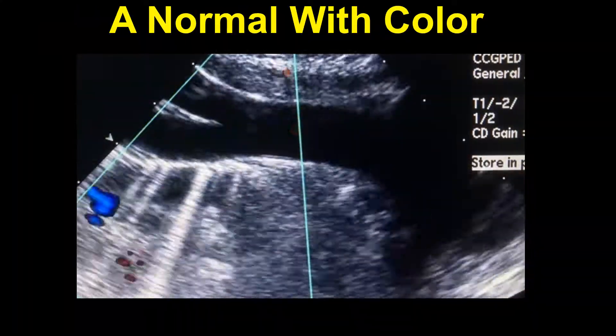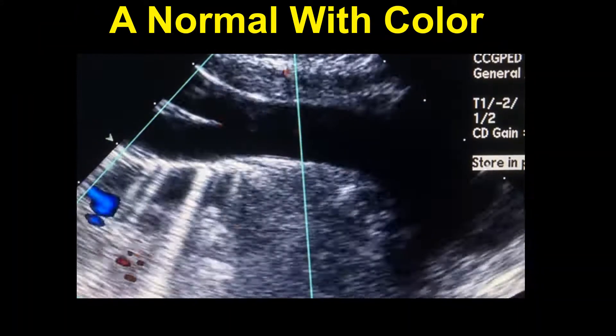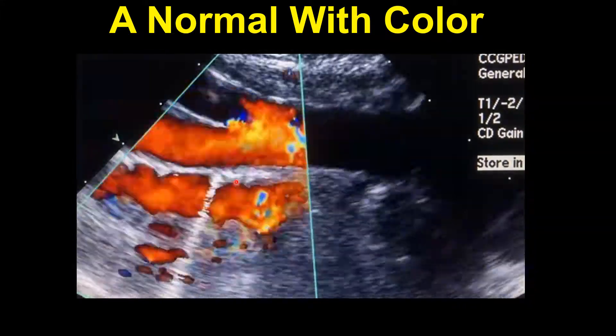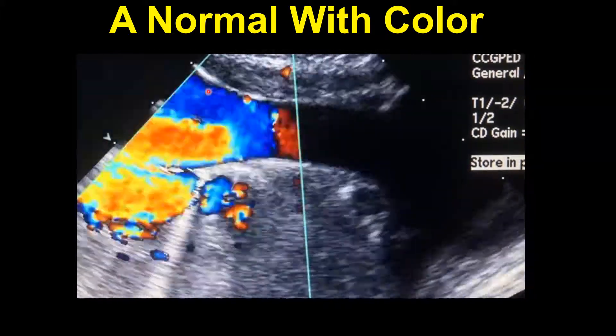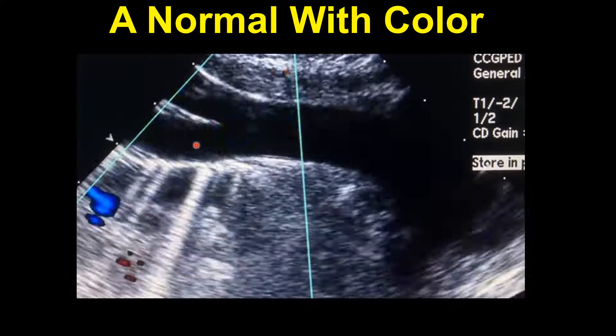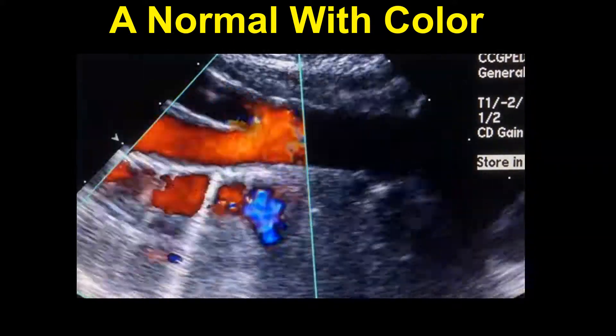Color Doppler is really helpful in showing how blood flows here and helps us to better see the bifurcation, just confirming that the right subclavian artery is present.